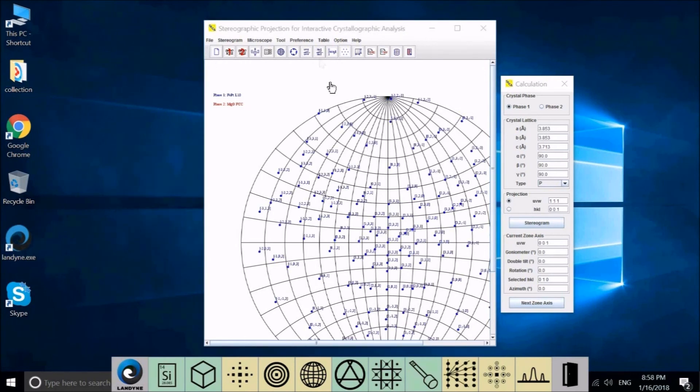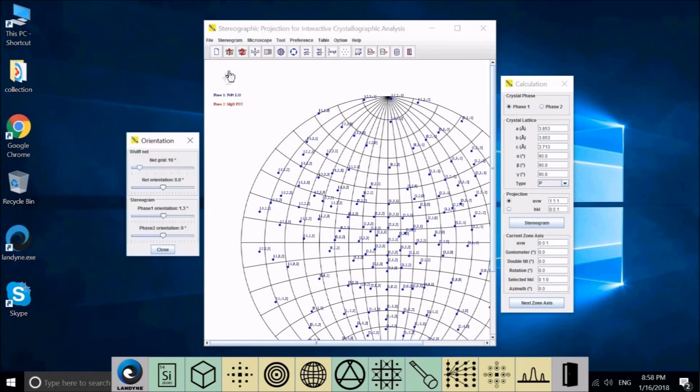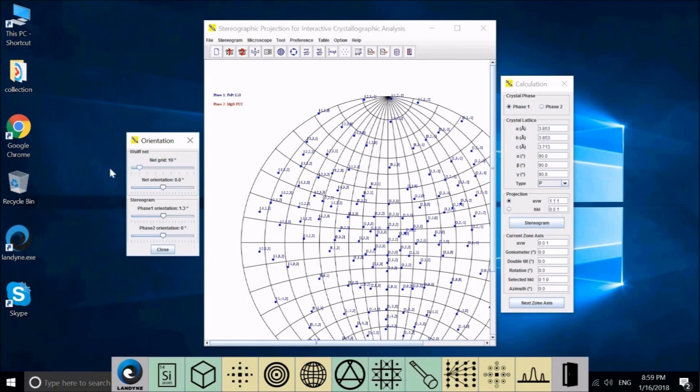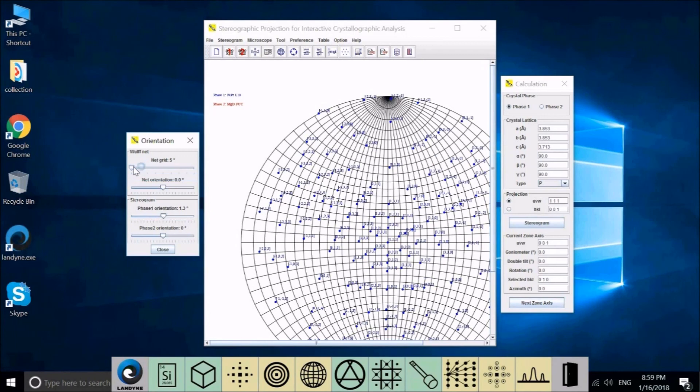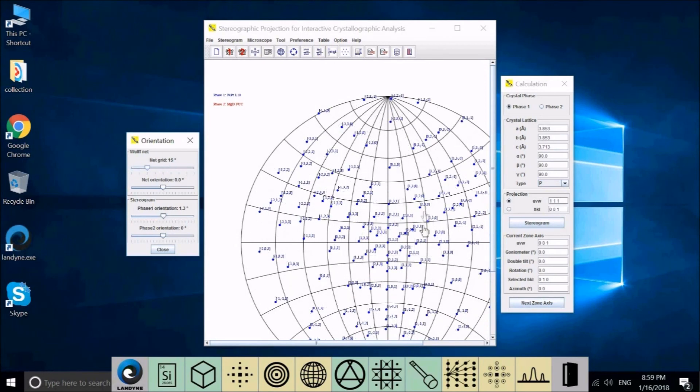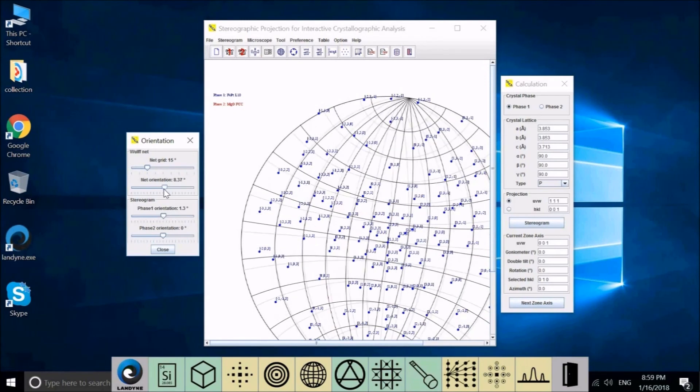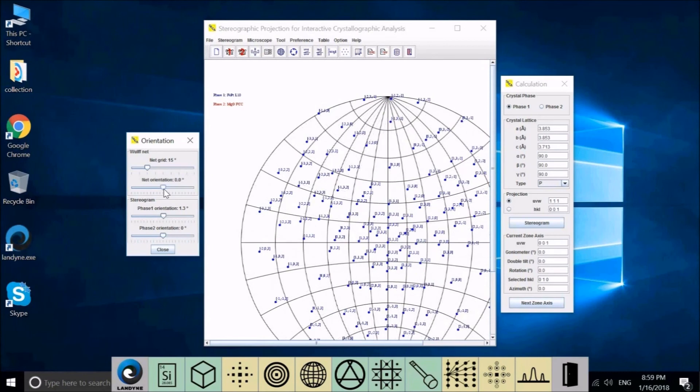Now I show you how to change grid setting and rotation of the Wulff net for the stereogram. Now it's 10 degrees. We want to decrease this to 5 degrees Wulff network. If you increase this to 15, and you can change the Wulff network orientation.